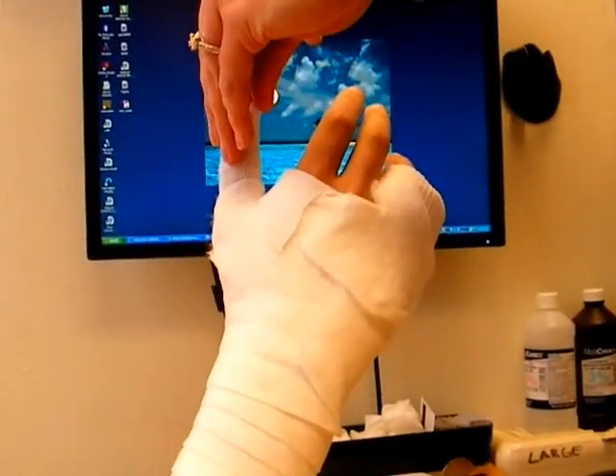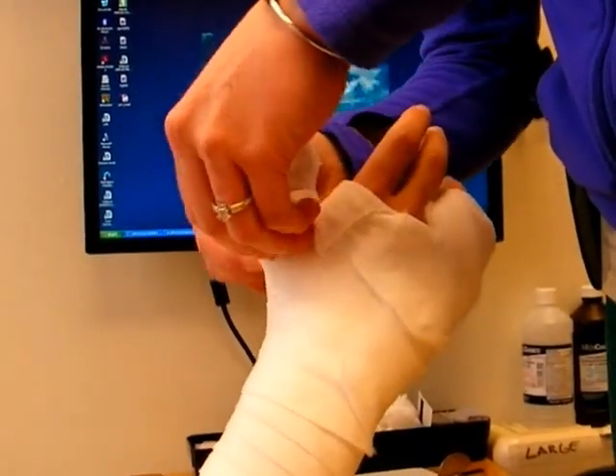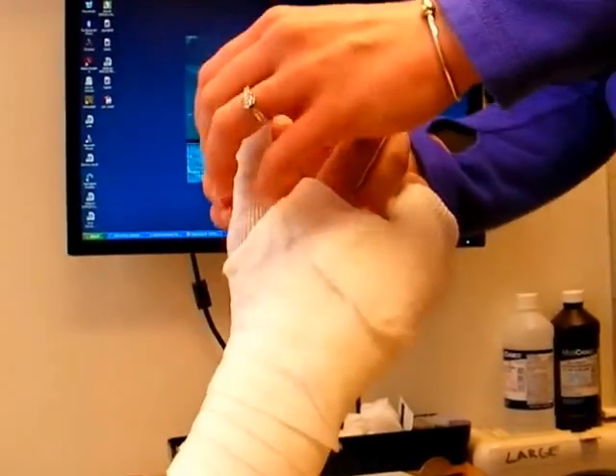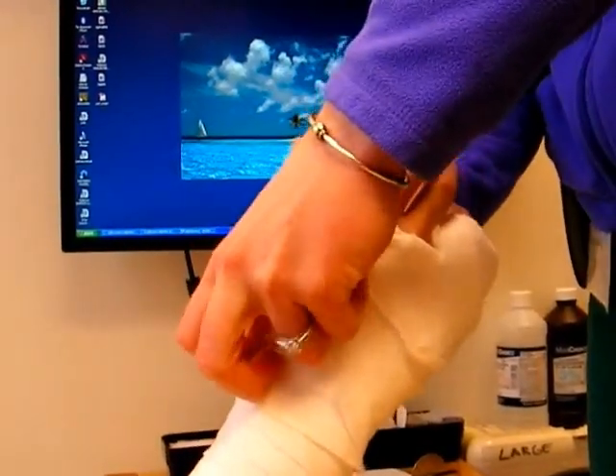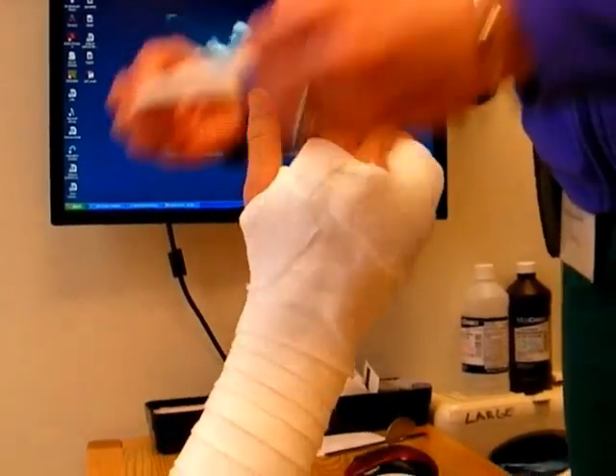After all of the cotton has been applied, the stockinette is folded back over the edges of the web roll just to make the edges of the cast neater and to prevent younger patients, especially small children, from picking at the web roll and pulling all of the padding out of the edges of the cast.